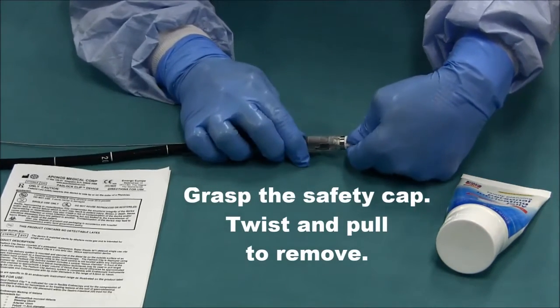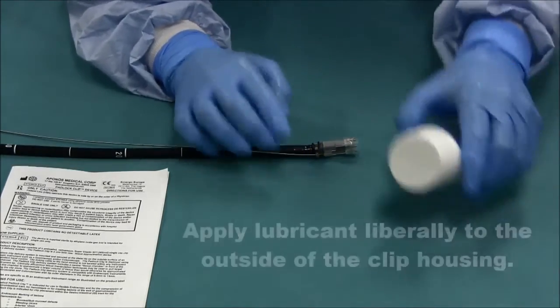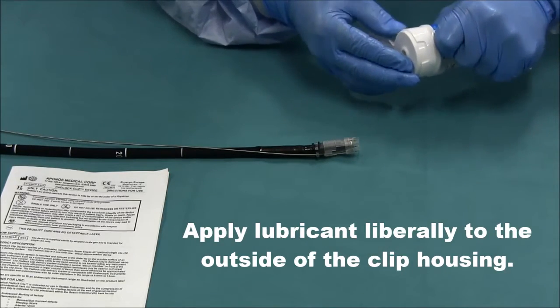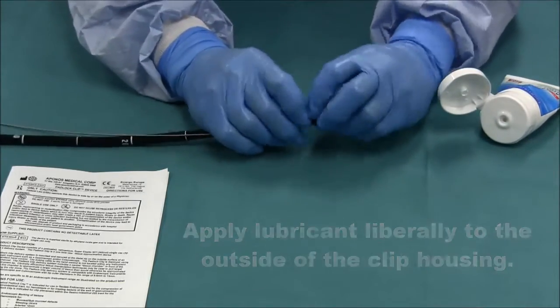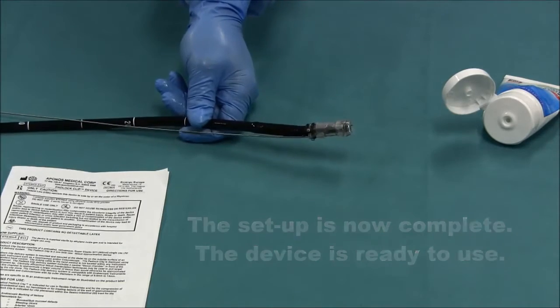Grasp the safety cap and twist and pull to remove. Apply lubricant liberally to the outside of the clip housing. The setup is now complete and the device is ready to use.